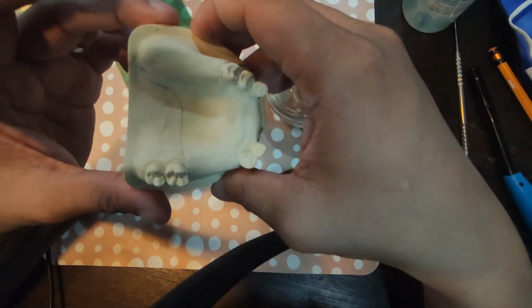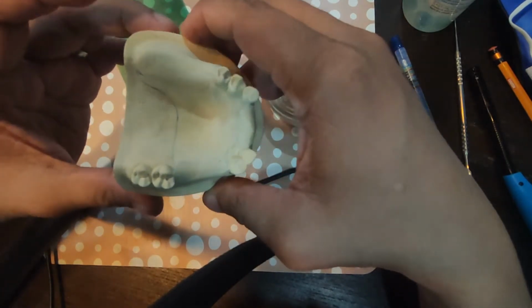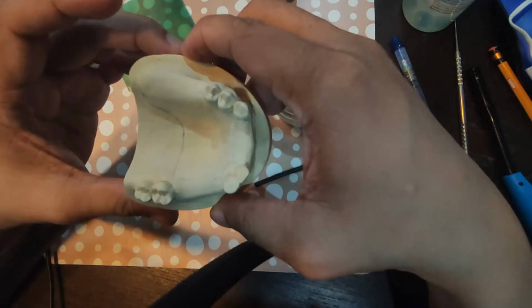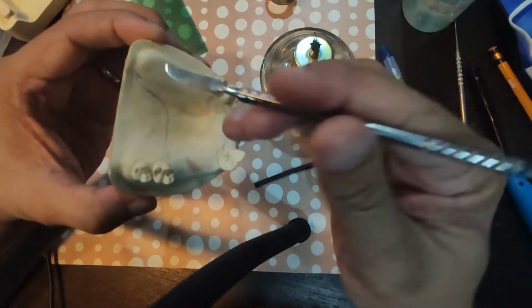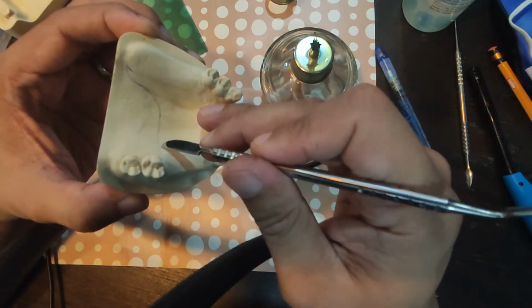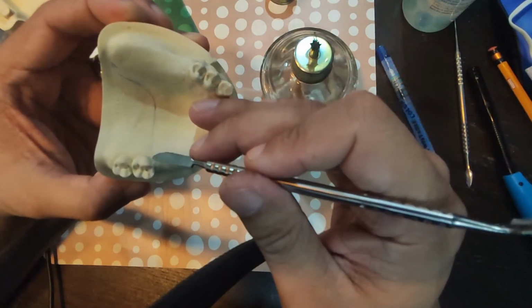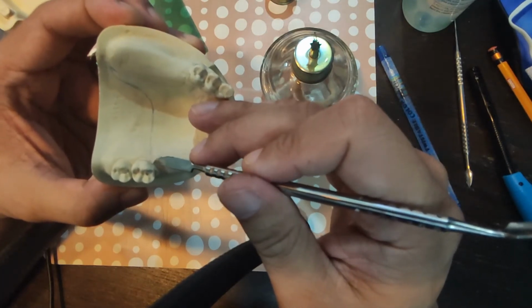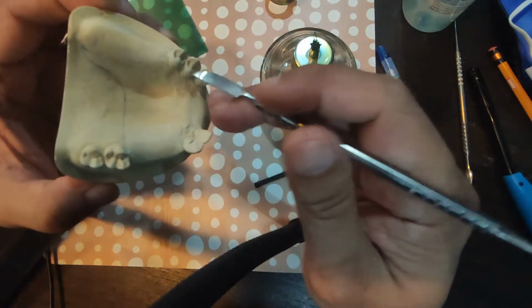The reason for that is I need to find out where I can put my blockouts, particularly my parallel blockouts, no? For this, for example, I know where the truss arm is going to go up to connect to the rest. So alam ko na dapat this undercut here will need to be blocked out. We'll need to have a parallel blockout.